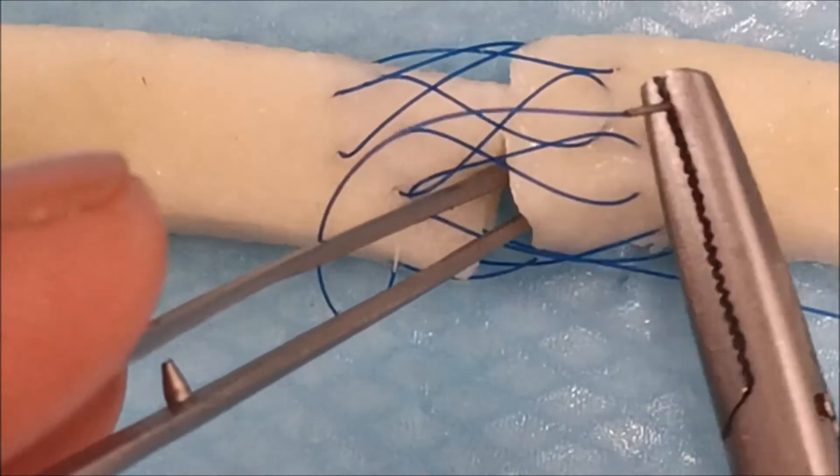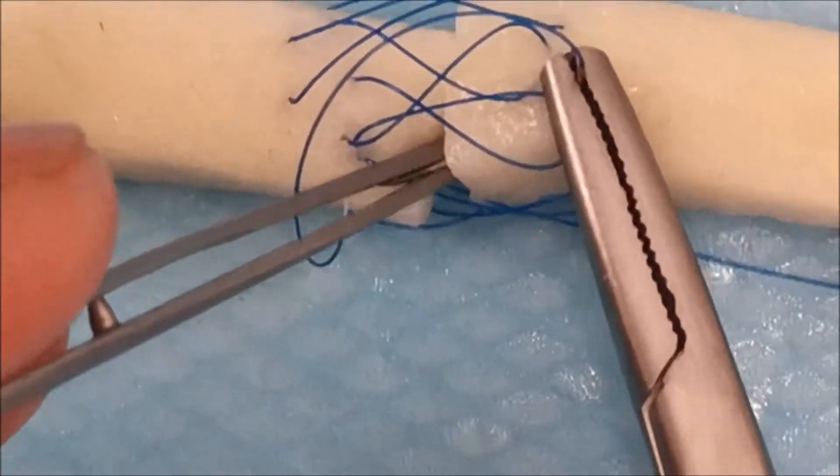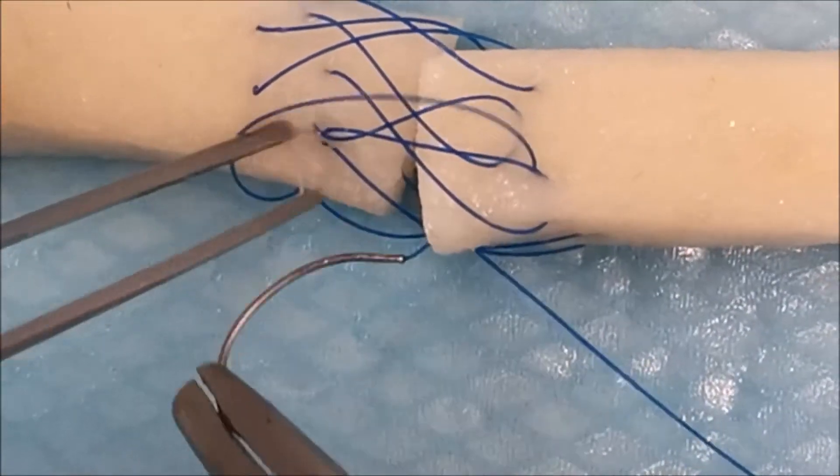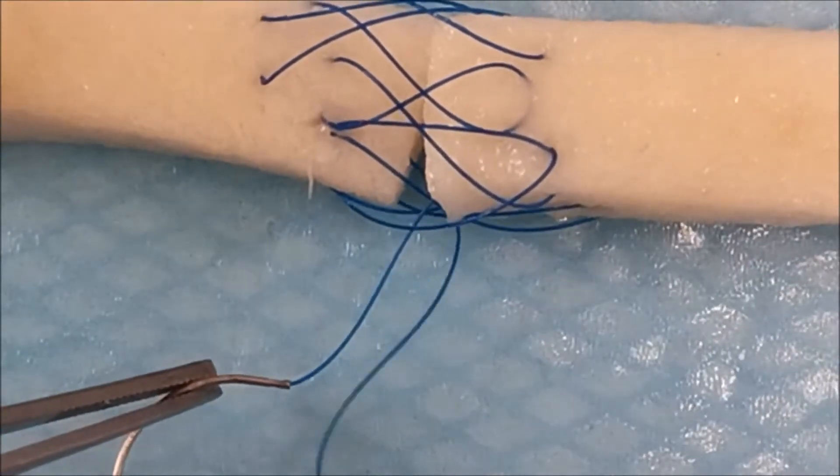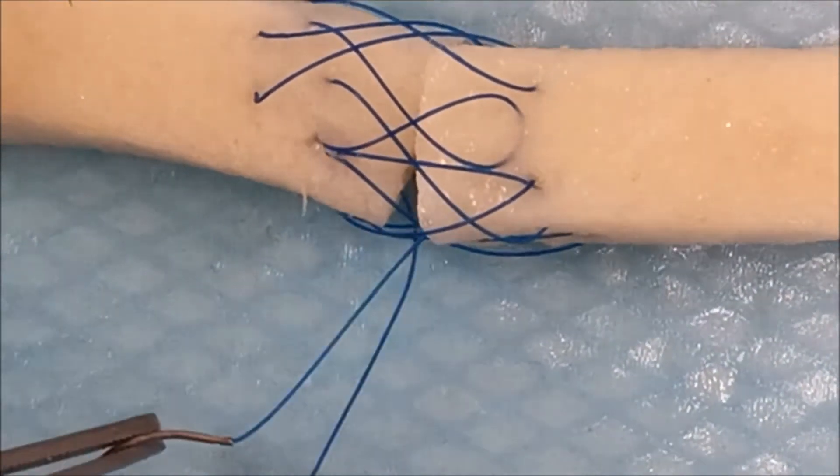I like to end it by going in the middle of the tendon again in order to bury my knot. As you can see, there's a net-like lattice figure of eight structure that surrounds the tendon.